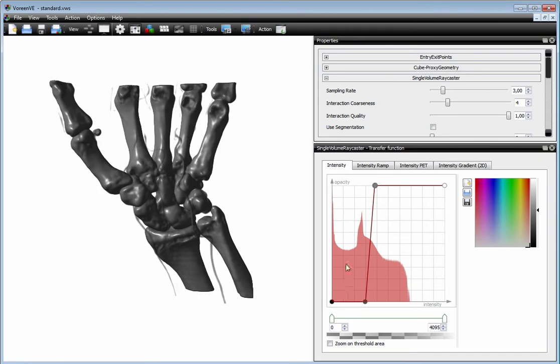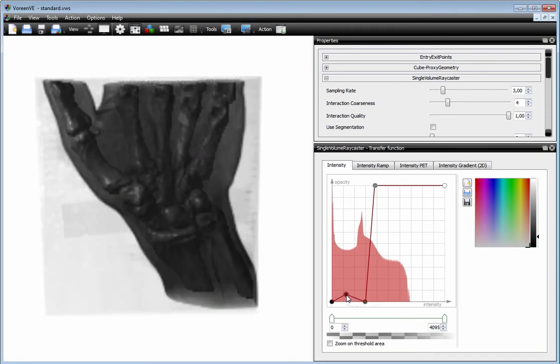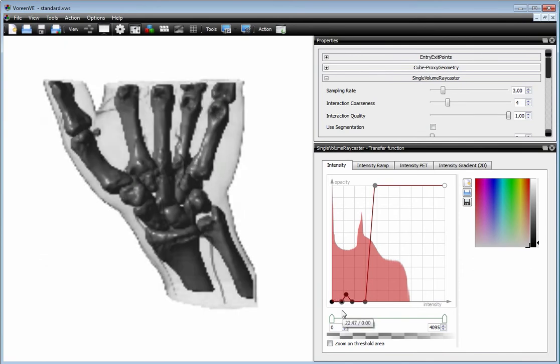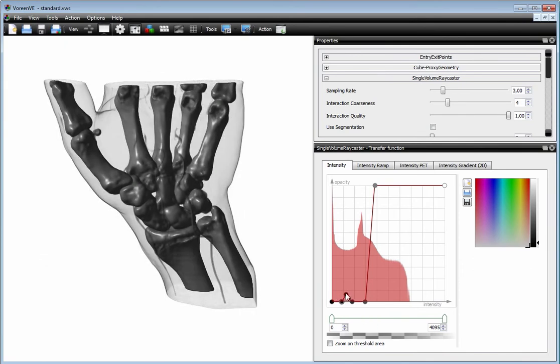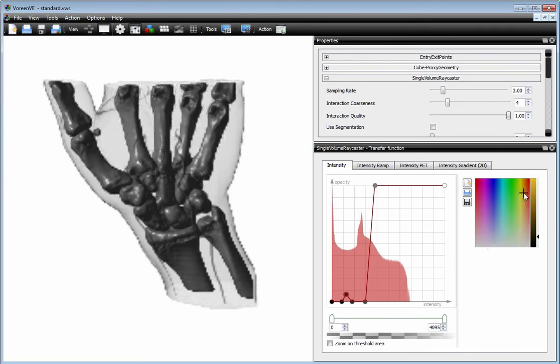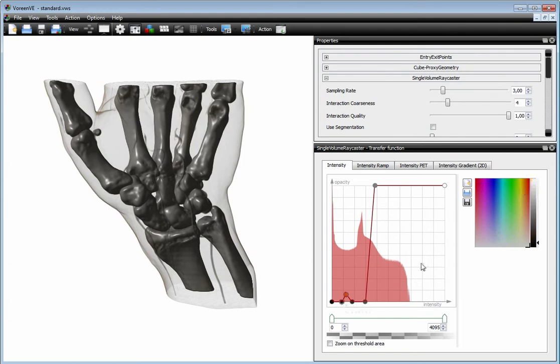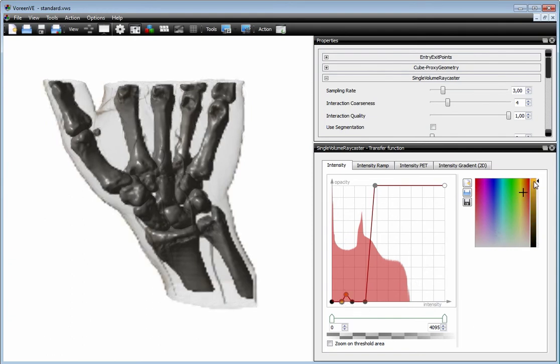Now we know that in CT, skin has a lower intensity than the bone, so to visualize the skin we just add a key here. Now we can change it by setting the color to a kind of skin-ish color and doing also for the neighboring keys.